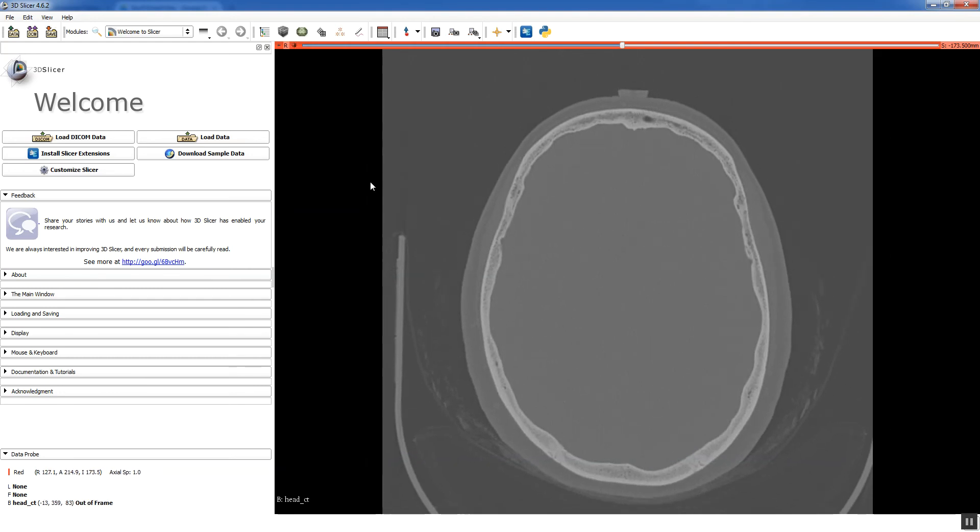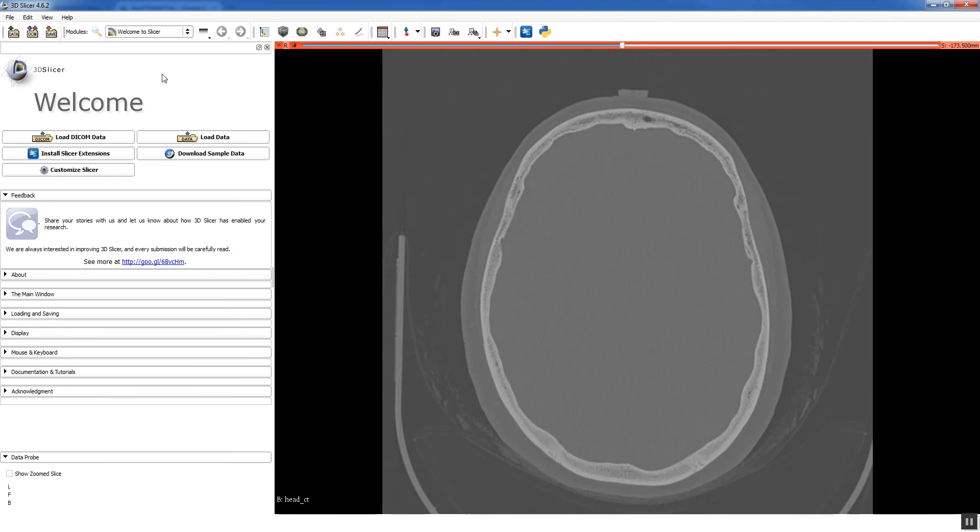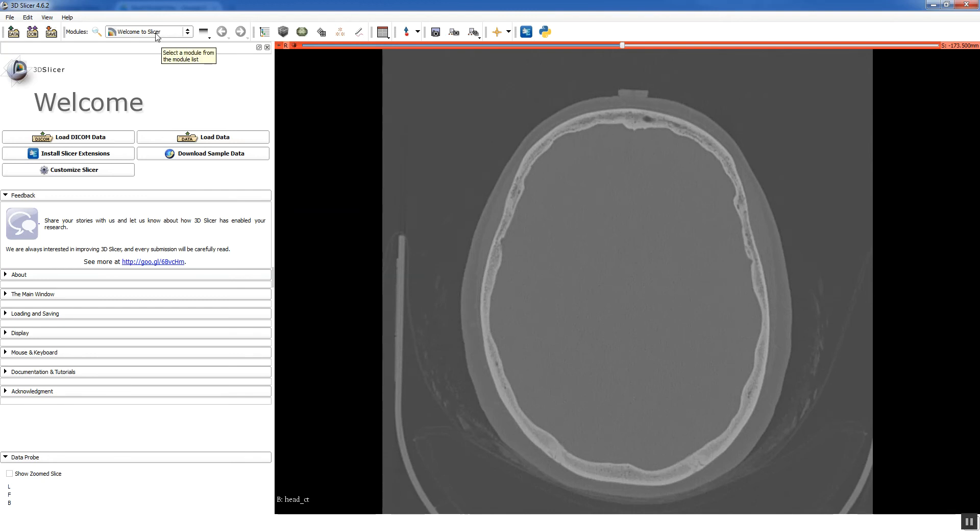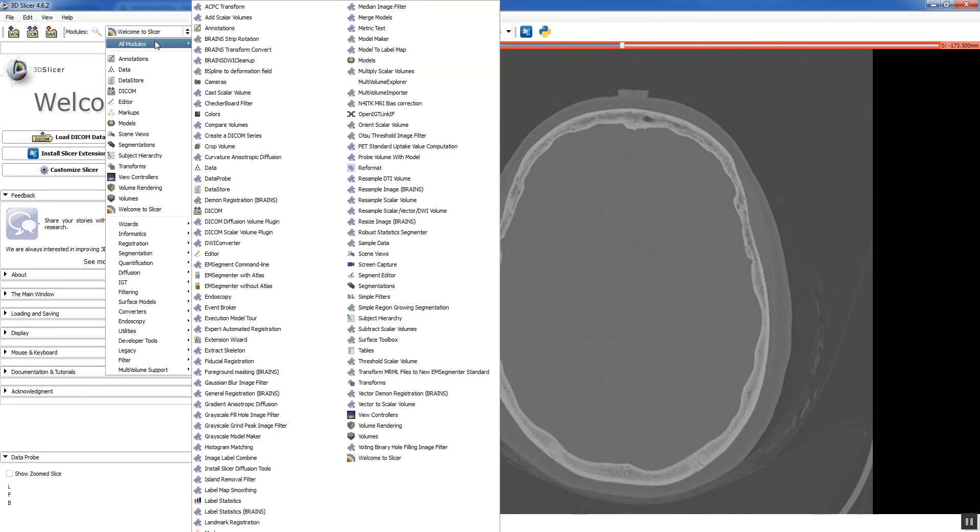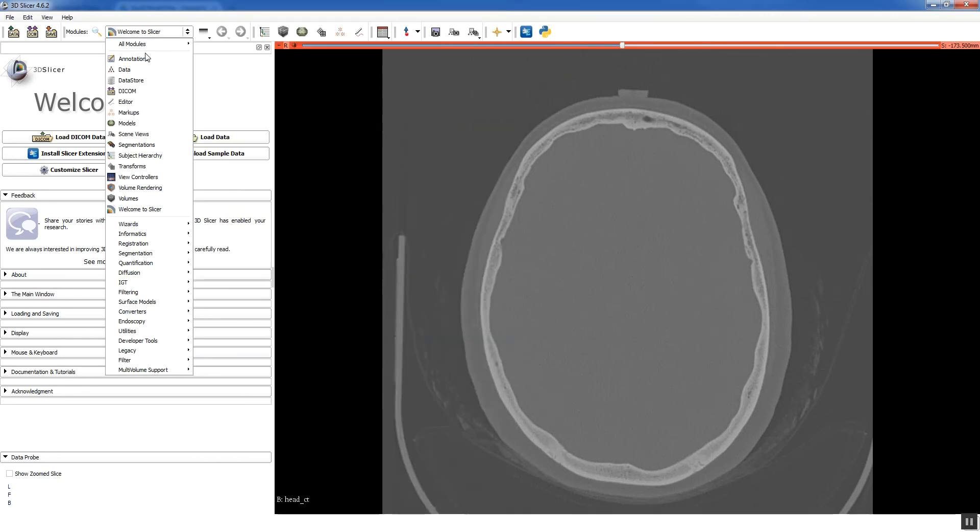Alright, so now we're ready to segment. Now just a word about segmentation. Segment is basically coloring. You're specifying the structure that you're interested in, and you have to do that slice by slice. Another thing to note is that everything in Slicer is organized through modules. That's anything that does something in Slicer is called a module. The segmentation module is called the editor.